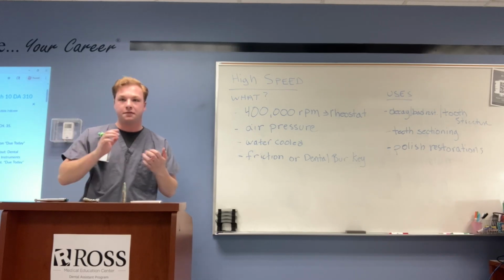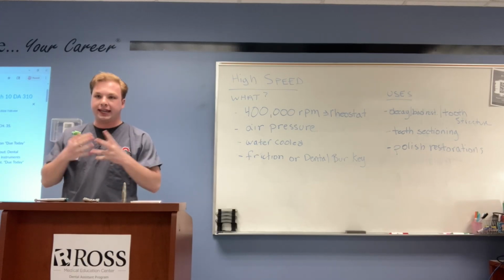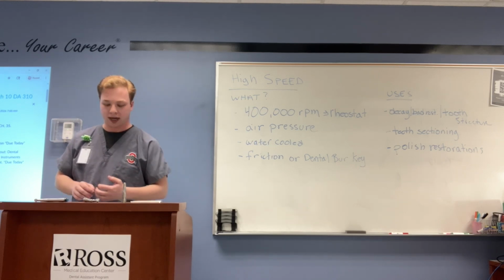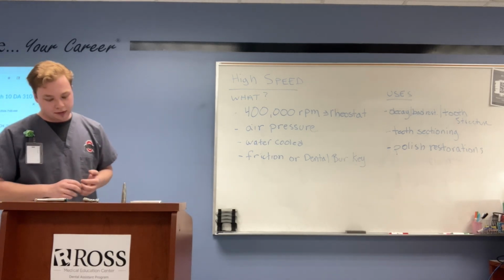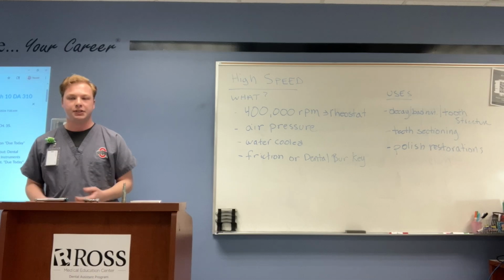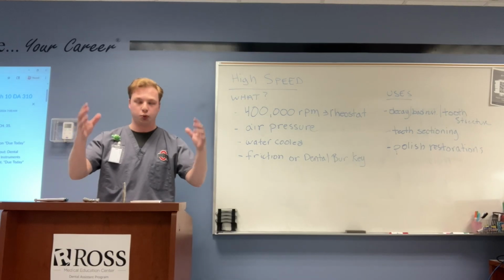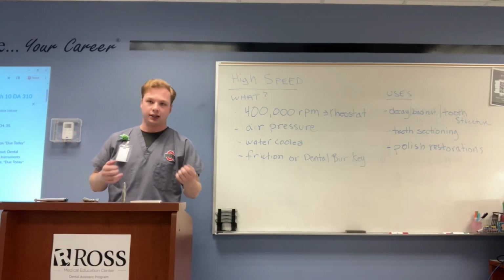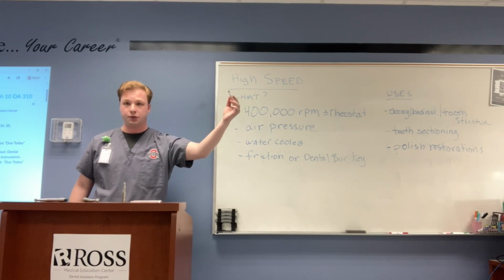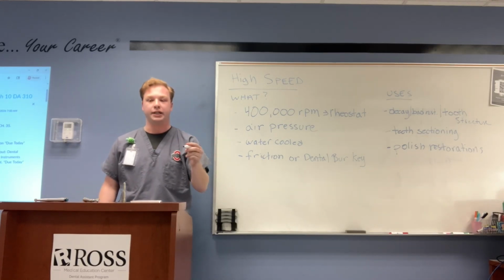Now there are 4 others that I'm just going to have you write down. They can be used in your office, but most likely you'll be trained on how to use them in your externship or at your job. The 2 that you would most likely see is the laboratory handpiece. Like if you're working at Aspen Dental, they do a lot of actual lab work like we do here. So you might see a lab handpiece, or you also might see an ultrasonic handpiece if you go on to hygiene. The ultrasonic handpiece is used to do scaling and root planing.